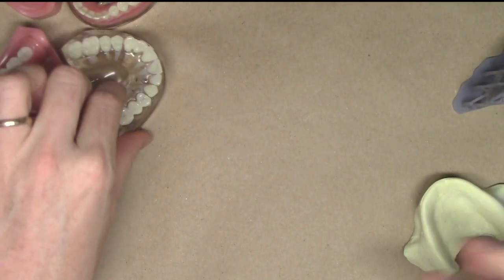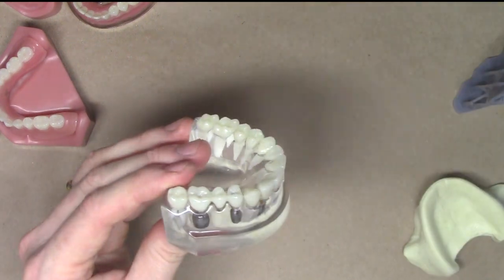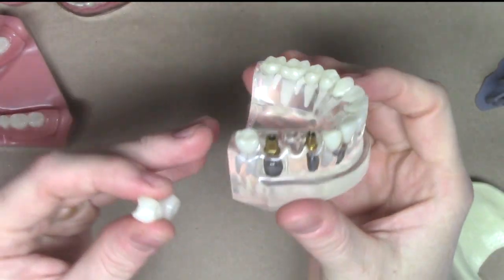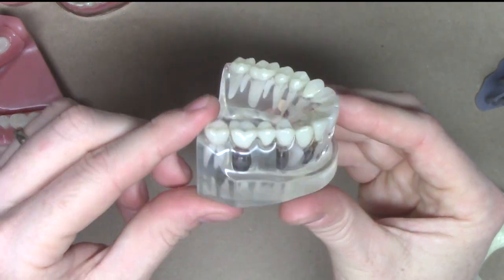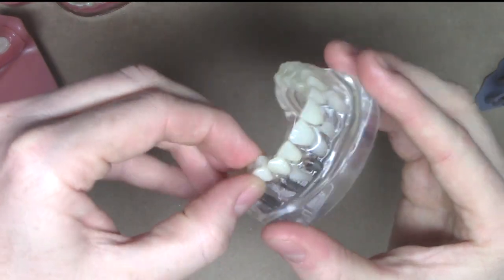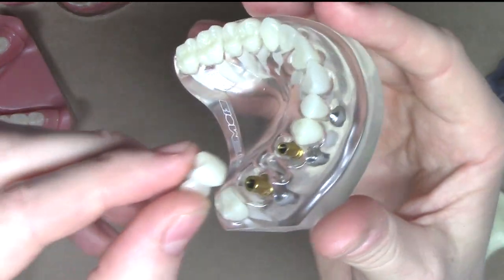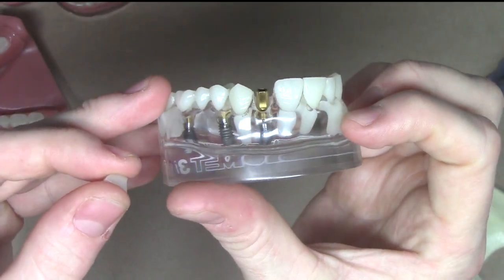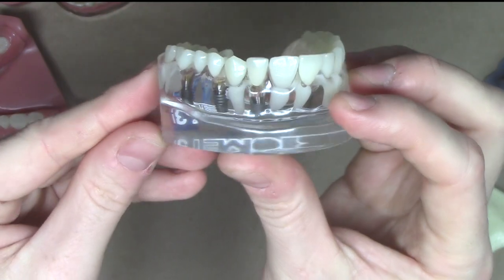And what that looks like is, we're pretty comfortable, and many of us in our clinical practices are used to seeing these types of models where we can show our patient the prosthetic options that are available to them. Like in this case, we're showing 2 dental implants with 2 abutments in place and a 3-unit fixed partial denture, or even just a single implant with a stock abutment and a single crown.